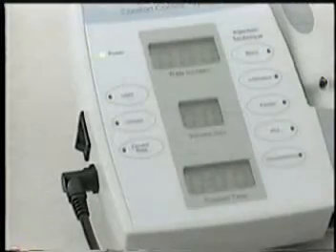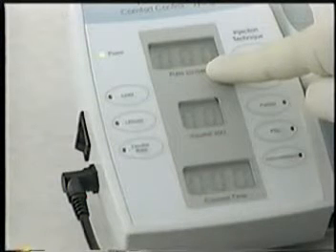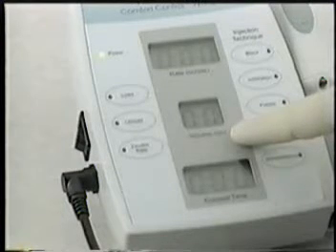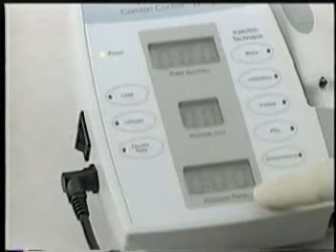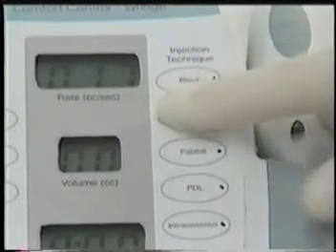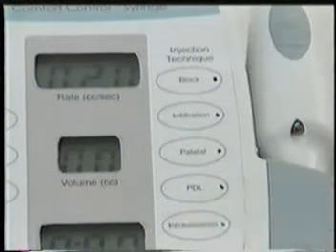There are three digital readouts on the unit that display rate per second, which is the injection rate in cc's per second, volume, which is the cumulative volume injected measured in cc's, and elapsed time, which is the elapsed injection time in minutes and seconds. On the right side of the unit are the buttons for the 5 injection types that are programmed into your CCS. These injection types are named block, infiltration, palatal, PDL, and intraosseous.